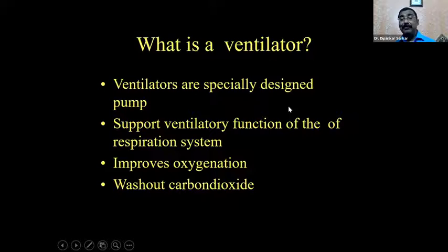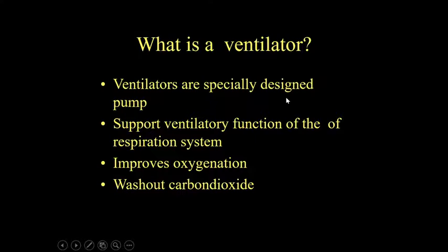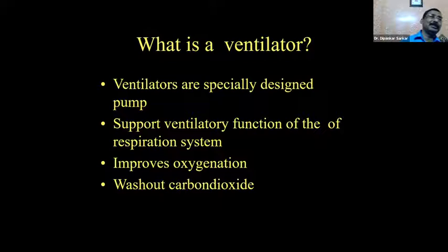The respiratory system has many functions. One of the functions is the ventilatory function. So what are the ventilatory functions? It improves the oxygenation and washout of carbon dioxide, which is reflected in everyday's arterial blood gas report. What is the oxygen level, and at how much FiO2? And what is the carbon dioxide level in that test? And what is the pH? So the function of a ventilator is plain and simple. It removes carbon dioxide and gives oxygen.